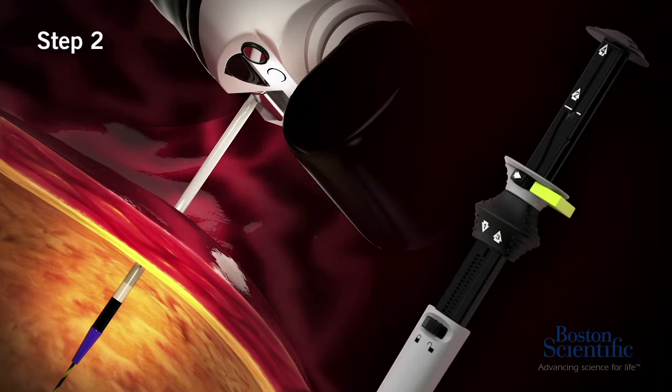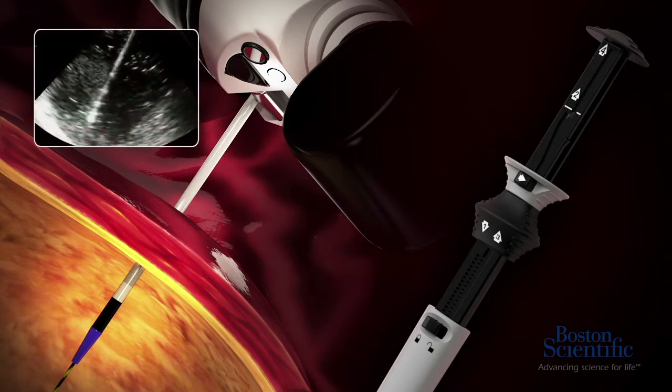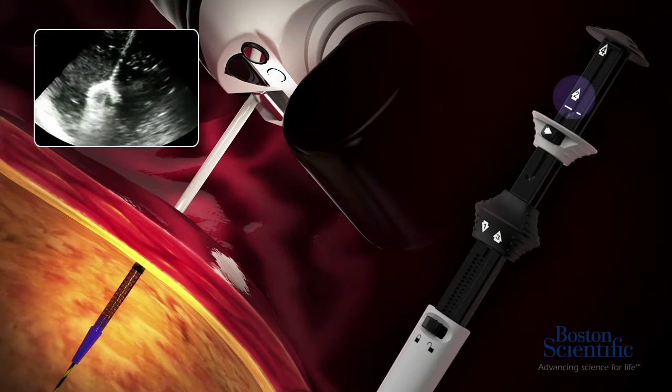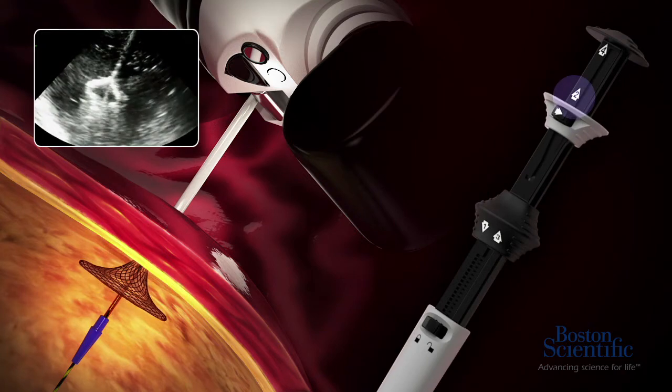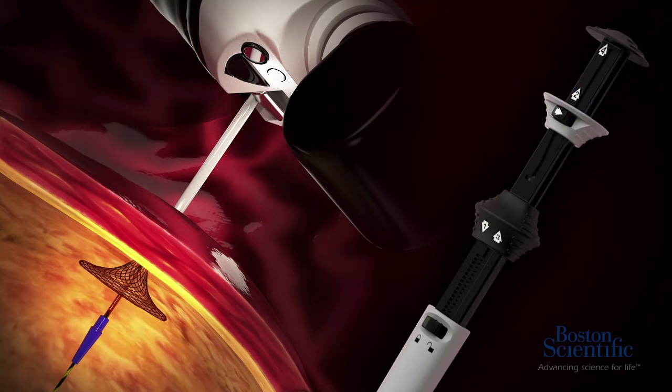Step number two. Deploy the distal anchor of the stent. Remove and discard the yellow safety clip on the stent deployment hub. Unlock the stent lock and slide the stent deployment hub upwards until the stent deployment hub locks into place at the white line next to the number two arrow.